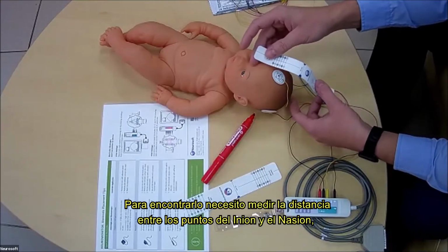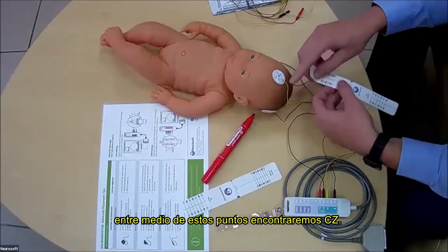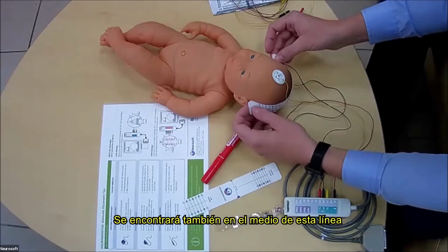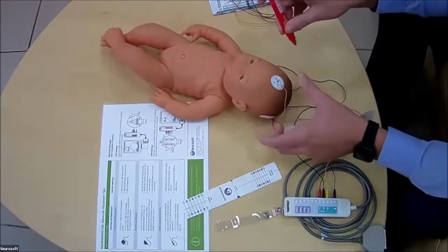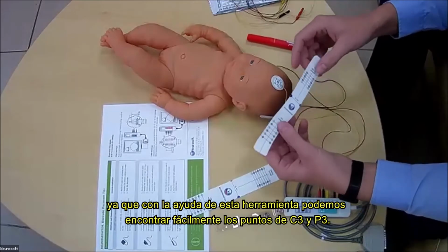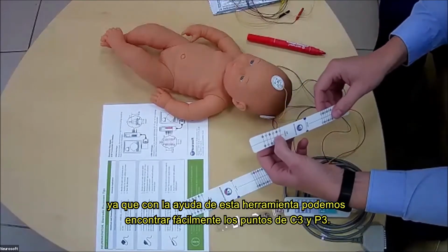distance between inion and nasion points. And in the middle of this distance will be the CZ. Also, it will be in the middle between the ears on this line. I can mark it with the special marker. This is the CZ. But actually, this point is not very necessary for us, because with the help of this tool, we can easily find C3 and P3 points.